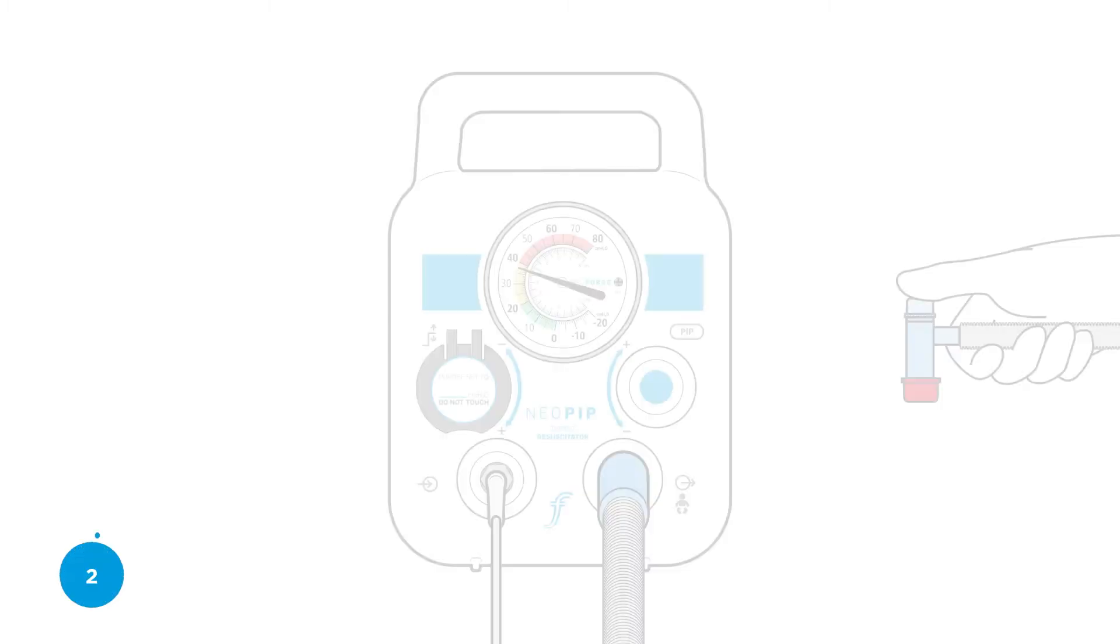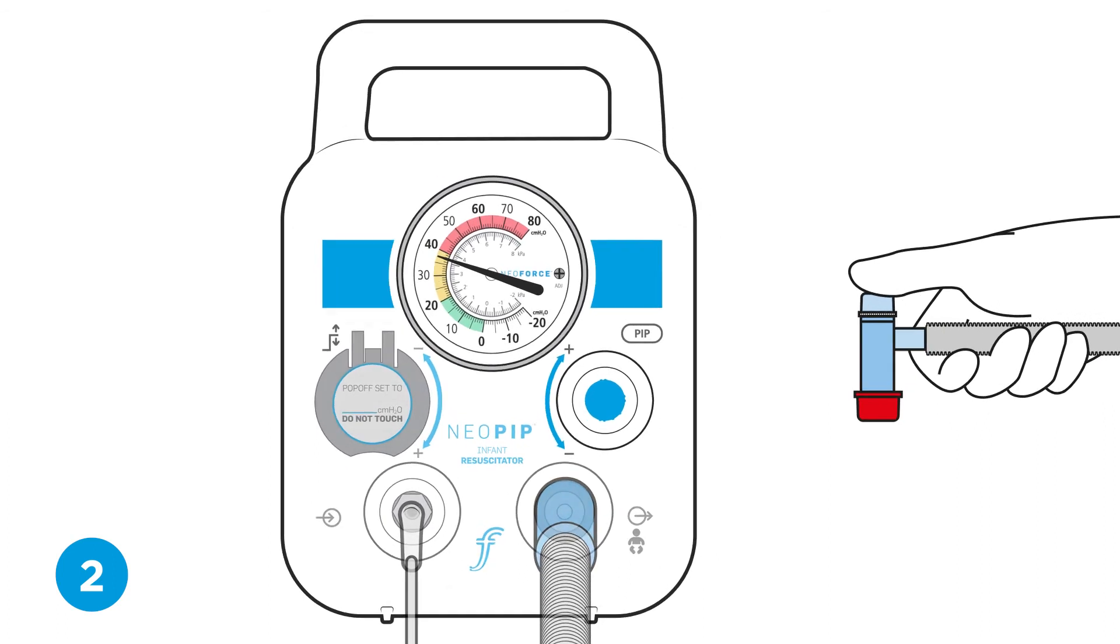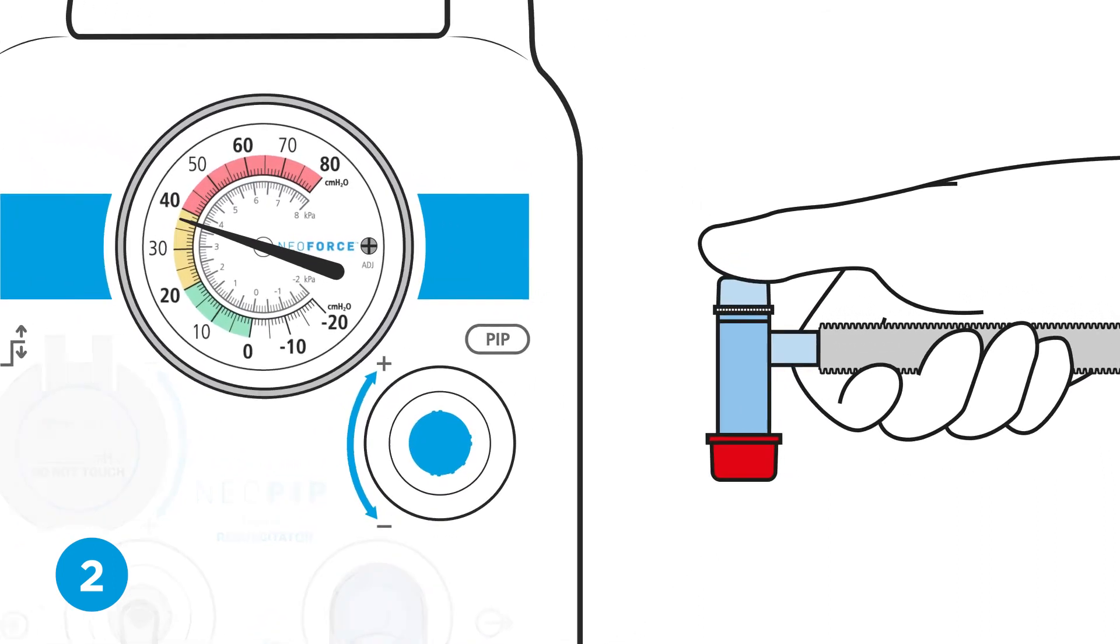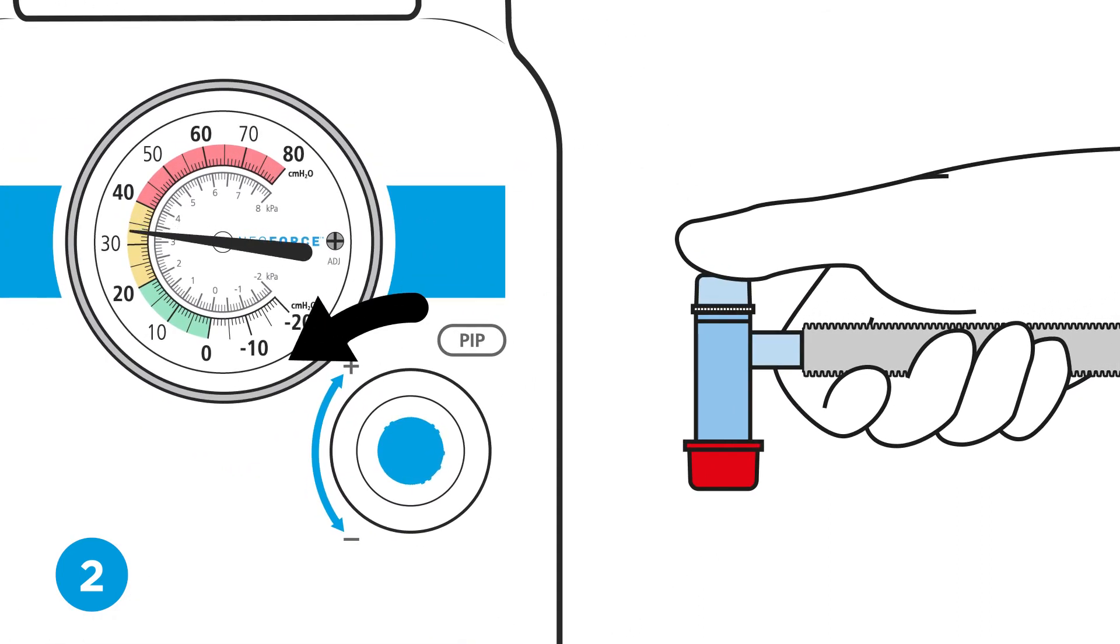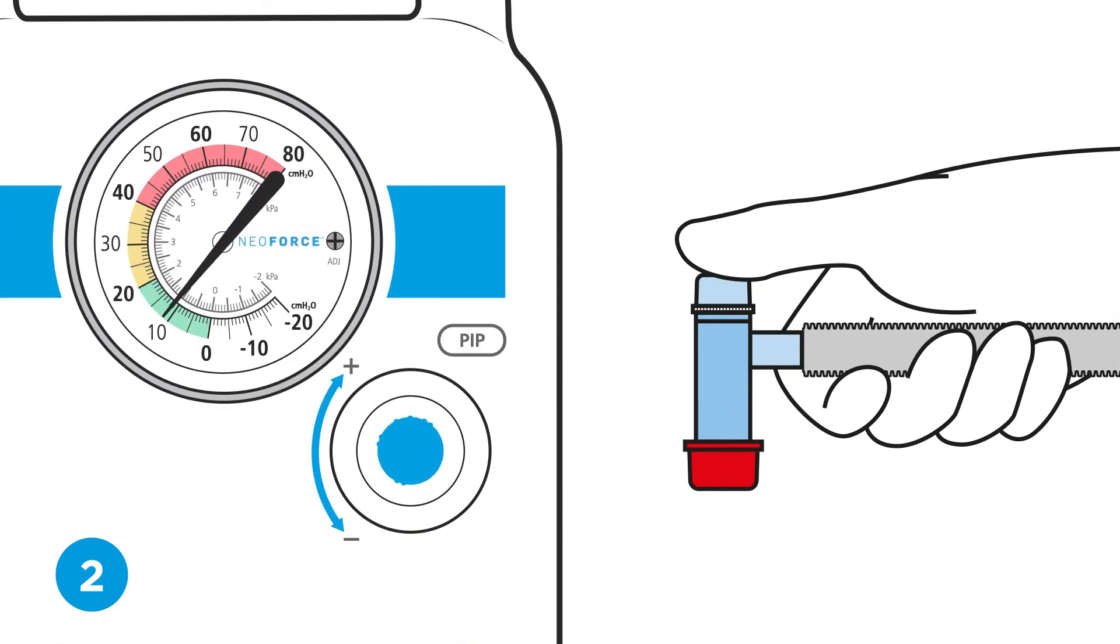Step two, set the PIP. With the TP circuit occluded, turn the PIP control to set the desired PIP and verify settings on the pressure gauge.